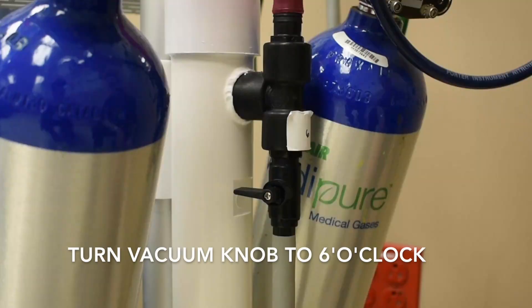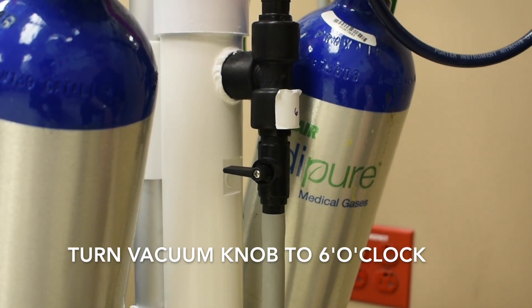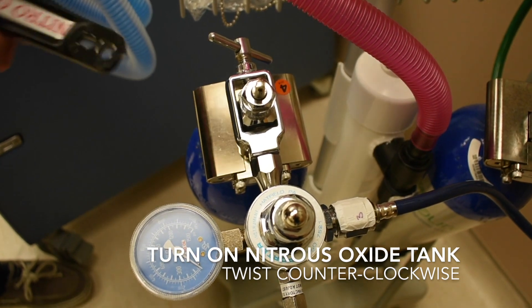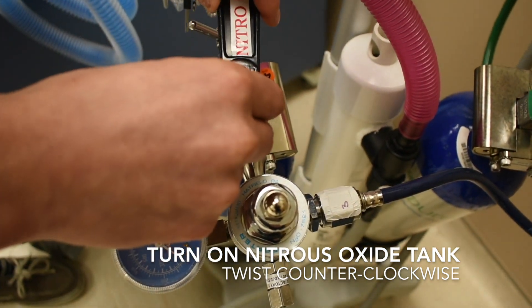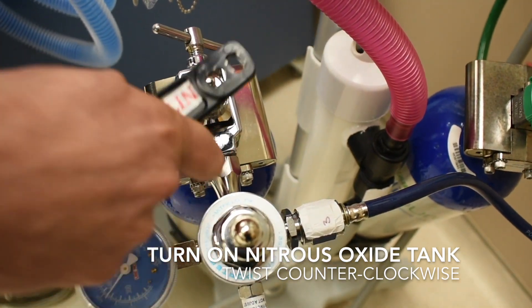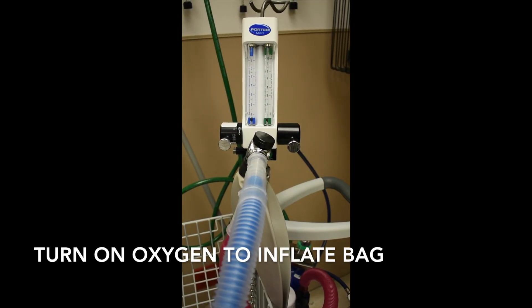Next, turn on the scavenging system by turning the knob to the 6 o'clock position — you should hear a suction noise. Open the nitrous tank by turning the black key counterclockwise as shown. You will see the pressure gauge in the bottom left go from 0 to at least 750 psi.